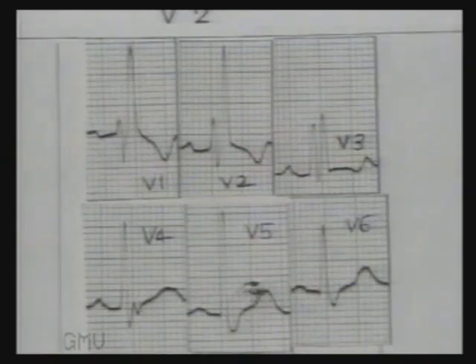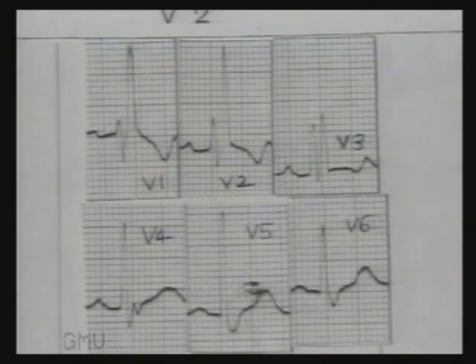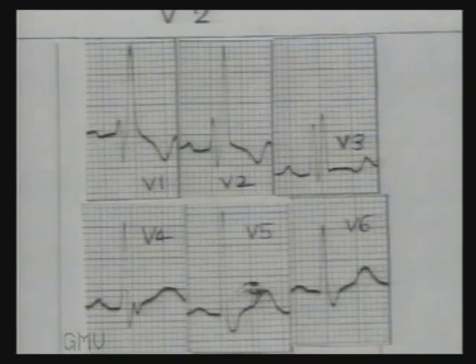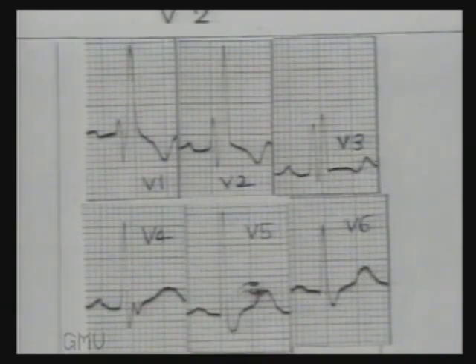In this ECG, measure the width of the QRS complex in lead V1 — it is 3 small squares. Note the RSR' pattern in V1 and V2. Note that the T-wave is opposite to the direction of the wide terminal QRS deflection. In V5 and V6, a wide S-wave is seen. So the diagnosis is right bundle branch block.